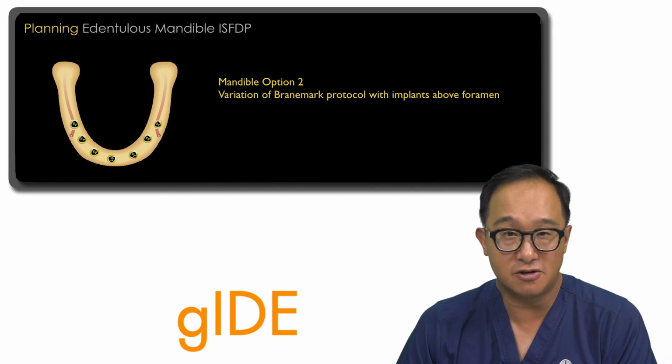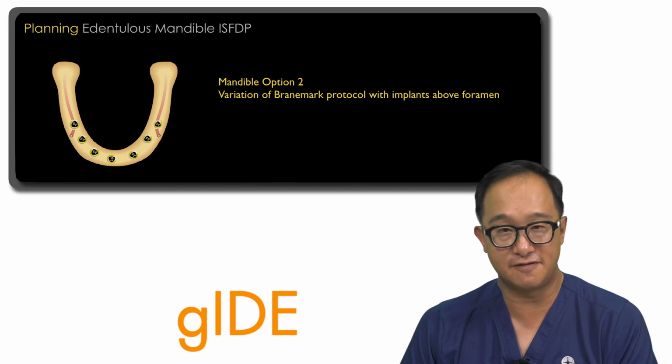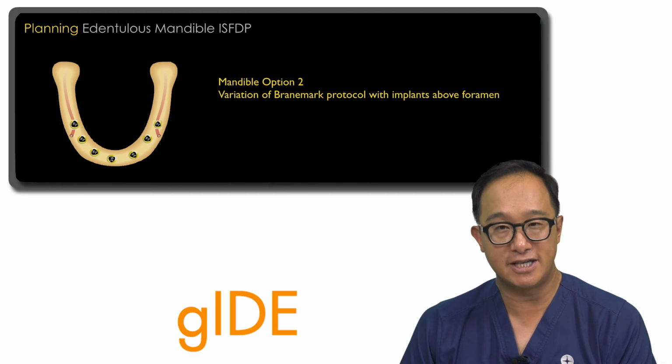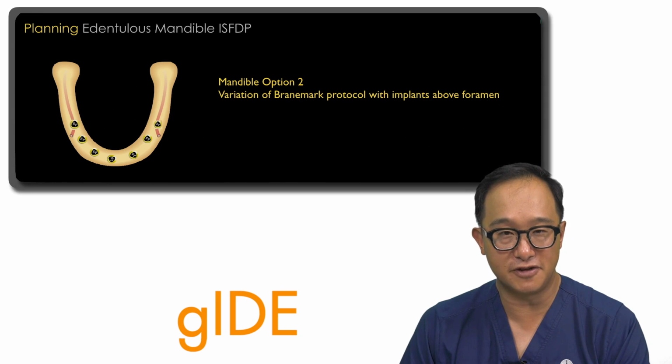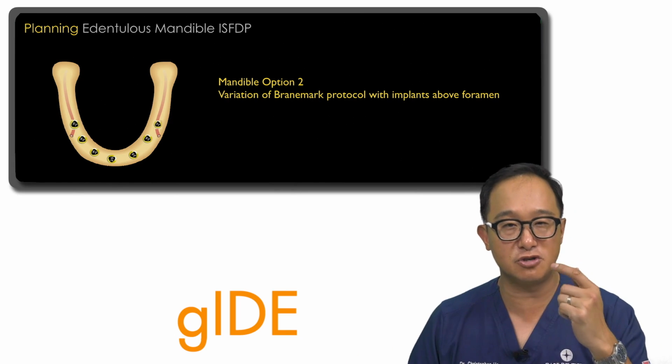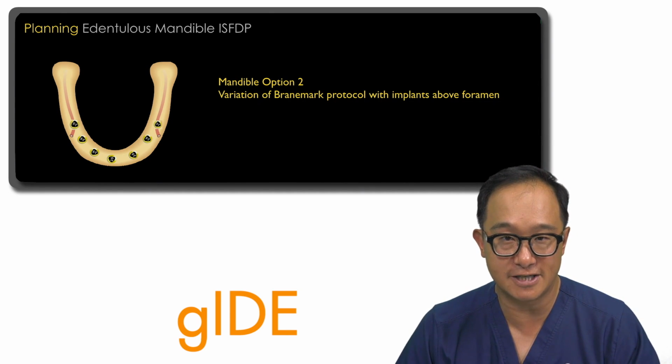So what is your second option? If you want to place more implants, instead of 4, you want to place 5 or 6 implants. If you place implants above the mental foramen, if there's sufficient height of bone that allows you to place implants, then this is not going to cause problems in terms of the flexure of the mandible. There's not too much change in the mandible in this position. So mental foramen to mental foramen, if you're placing implants, this will not be such a problem for the patient.